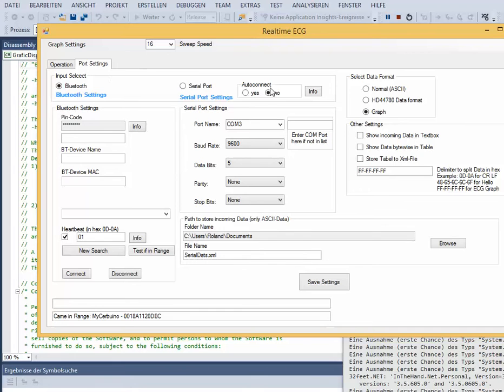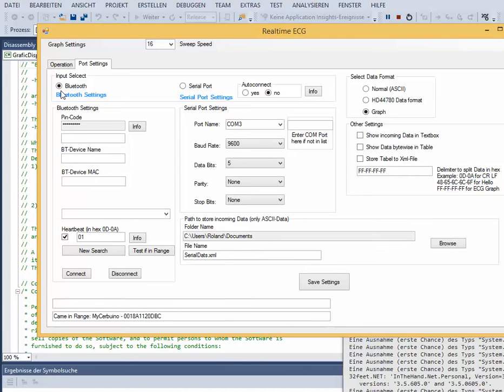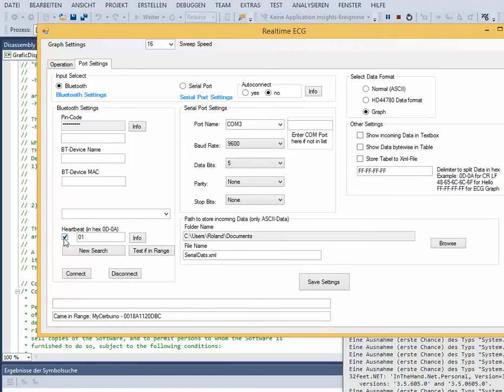You can select whether you want to use Bluetooth or the serial port. We use Bluetooth. Activating heartbeat allows automatic reconnection of Bluetooth when the connection is interrupted.